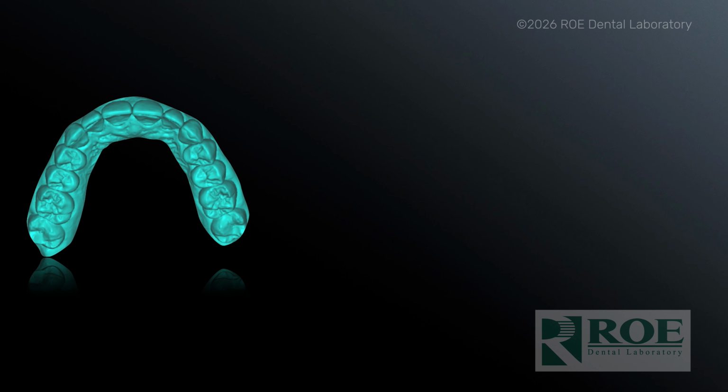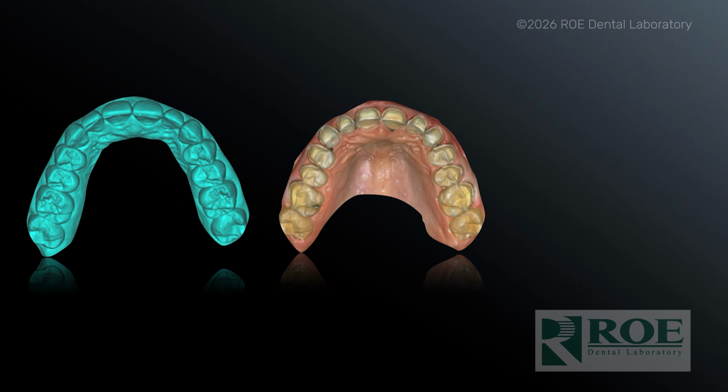Got our mock-up. Now we're good. We can either 3D print the model. You could also have the lab 3D print the mock-up for you if you don't have a 3D printer. That's okay. And then we're ready for prep. And we know how we're going to prep based on that mock-up.